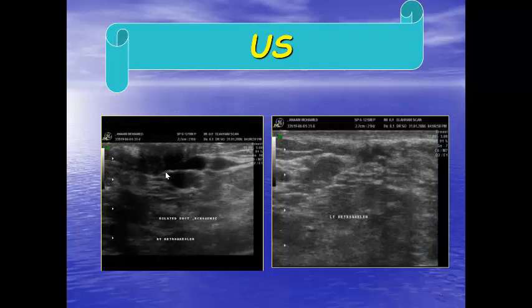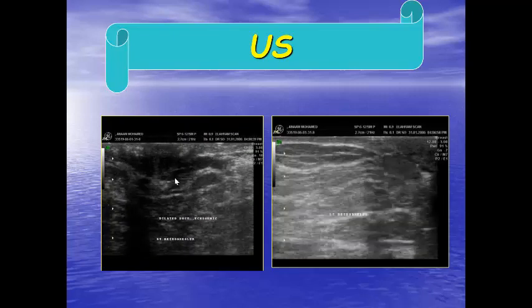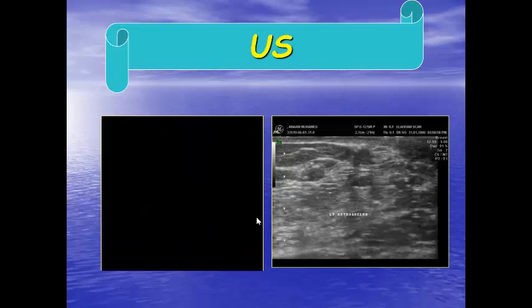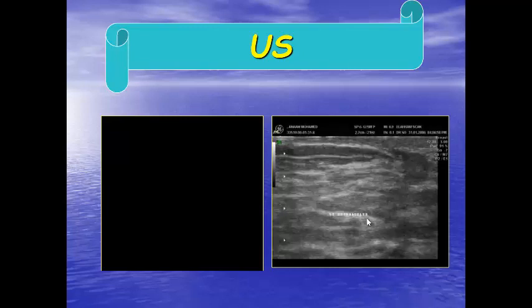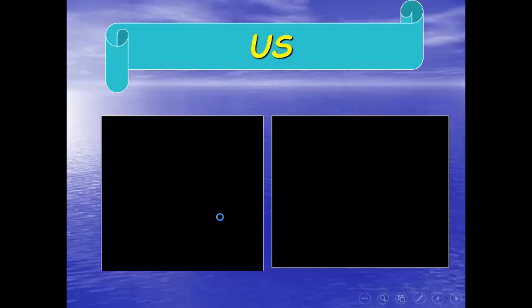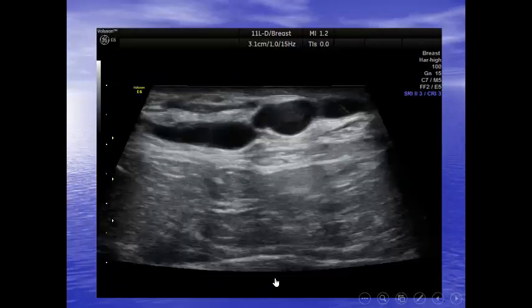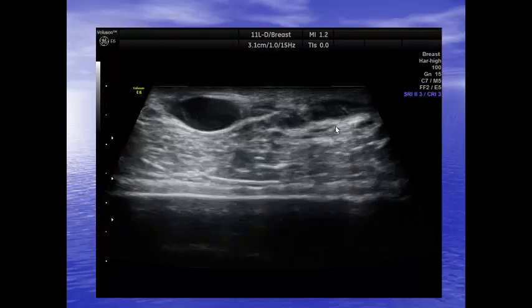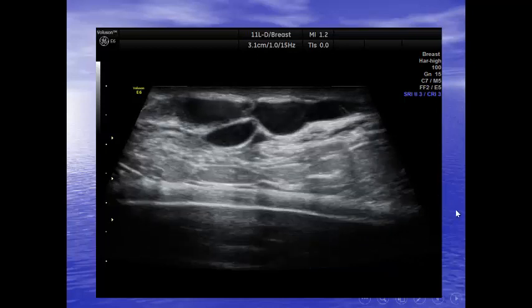This is another case showing the nipple and localized duct ectasia. If we stop at that position we will not see the mass — we have to look carefully. Here, another duct shows inspissated secretions with low-level internal echoes inside, but there is no solid component. This is also localized duct ectasia. We have to go as lateral as possible in order to be sure that there is no mass at the end of the duct.